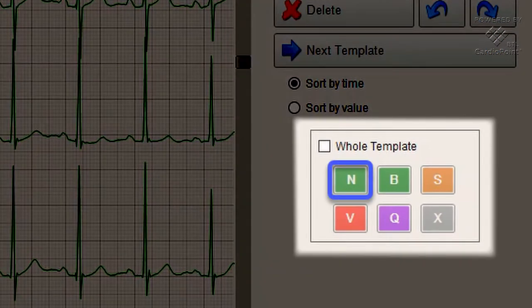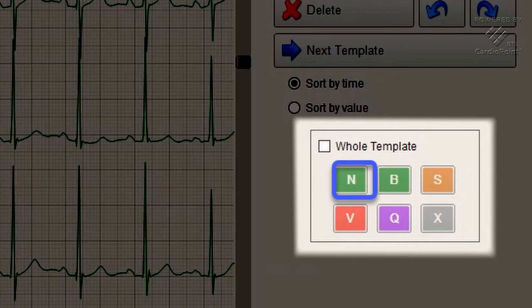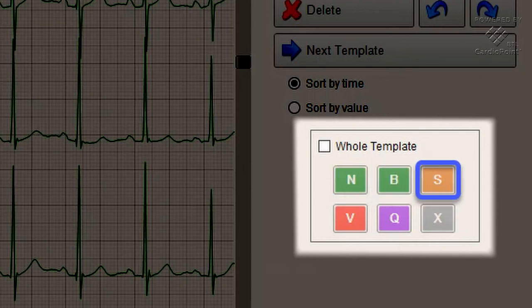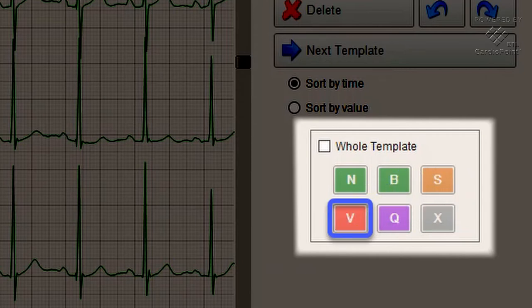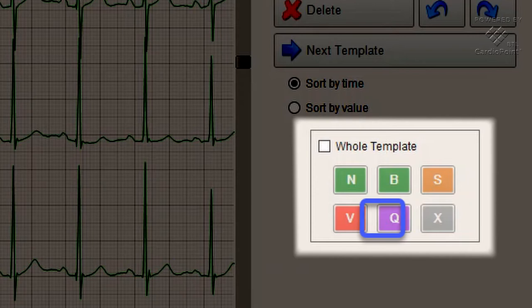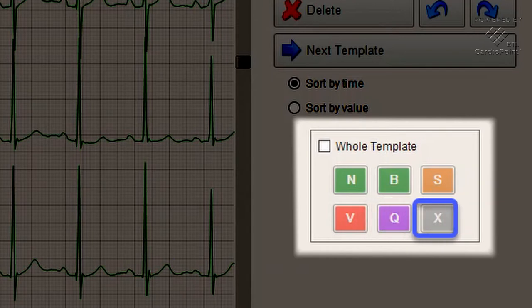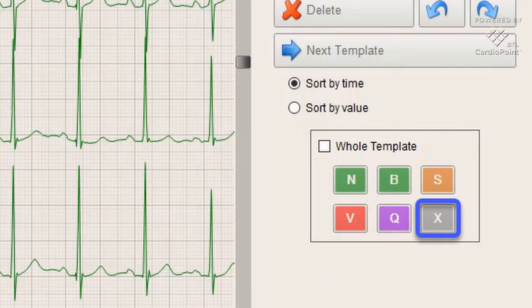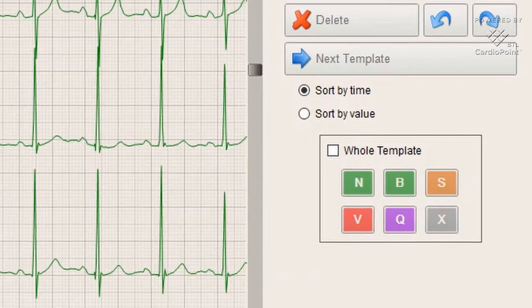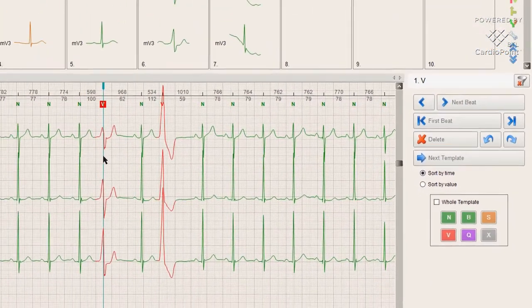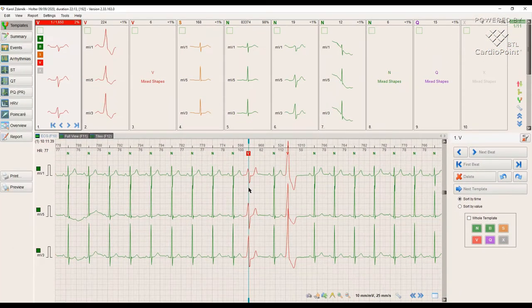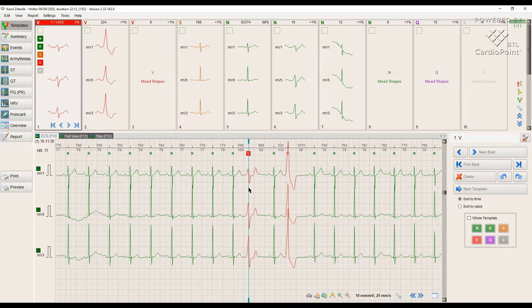N: Normal beat. B: Bundle branch block beat. S: Supraventricular beat. V: Ventricular beat. Q: Undeterminable beat. X: Artifact. The doctor's task is to look through all the templates and make sure that the program has correctly distributed all the heartbeats.